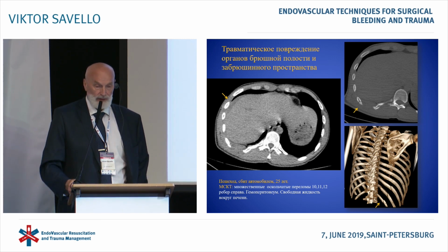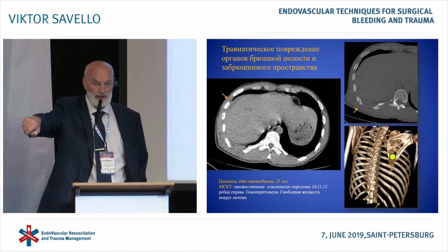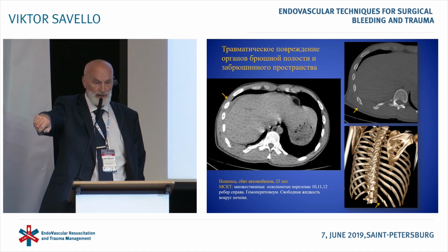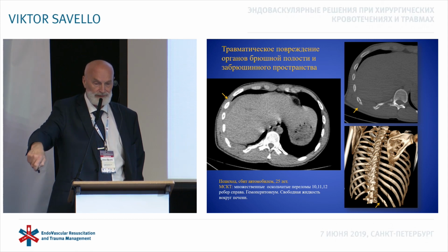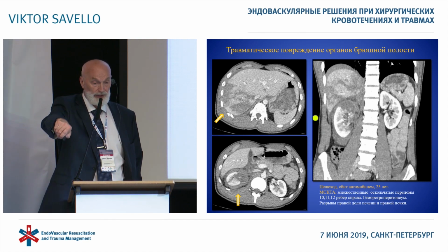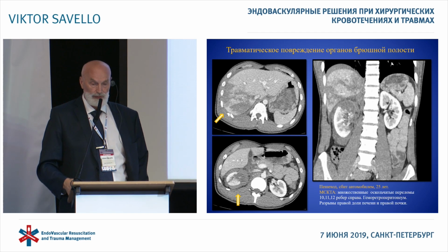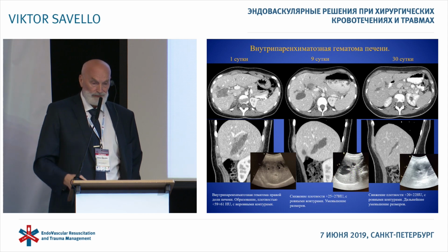This is a combined trauma, polytrauma. Initial visualization shows the fractures of 3 ribs on the right, and this is an almost direct indication for liver failure and liver trauma. We see also hemorrhage and blood in here, and here is liver. We do CT angio on the liver, and we clearly can visualize a large rupture in the right lobe of the liver, and then we can see a hemorrhage in the area of kidney in abdominal and periabdominal area.